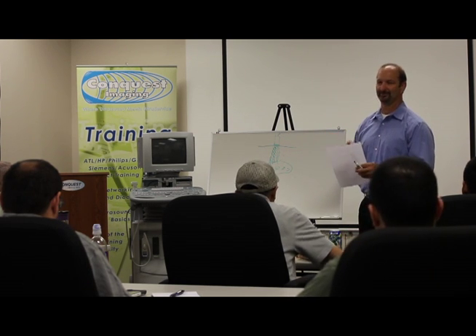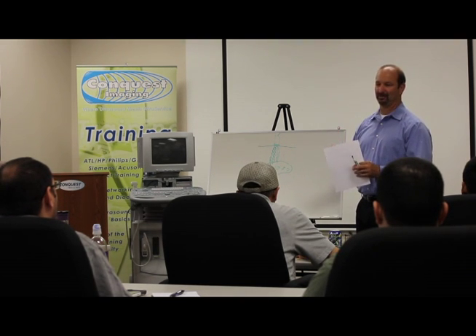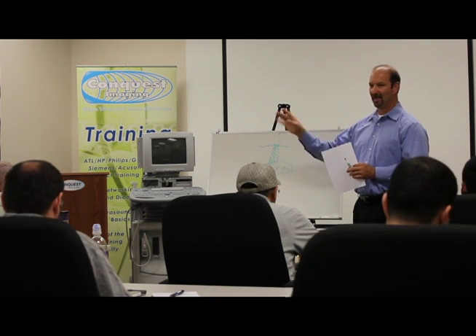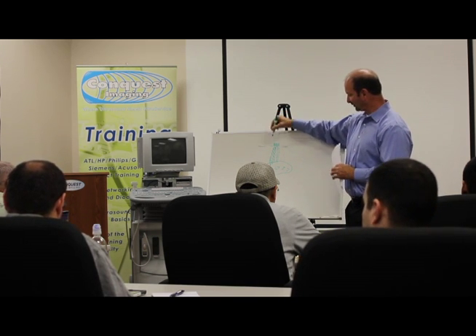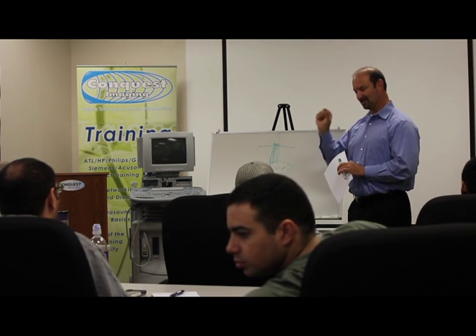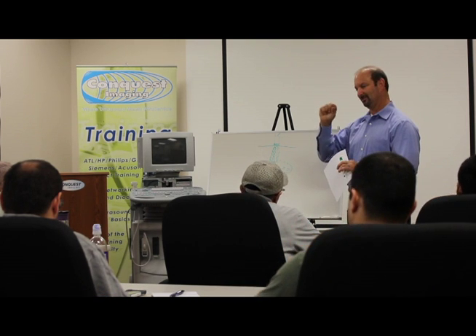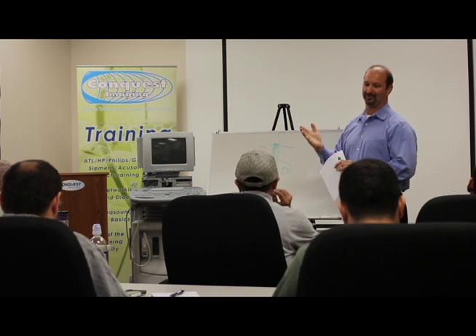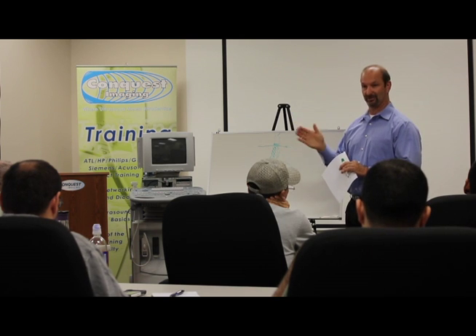So it'll do that, let's say 5,000 times, which is probably 1/50th of a second. It'll do it 5,000 times, and then it'll listen to what comes back. So these same crystals right here will pulse 3 times and stop for the period of a pulse. Do that 5,000 times, and that creates a frame, and on a 4V1, it'll do that 25 times every second. That's where you get your frame rates.